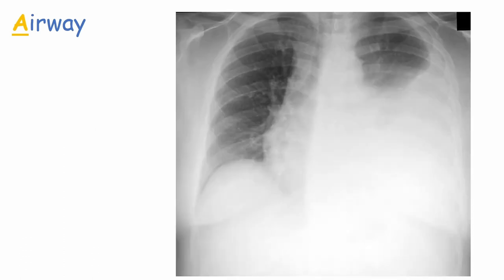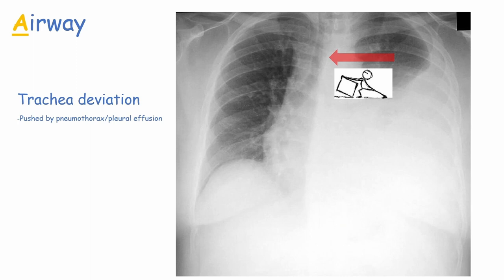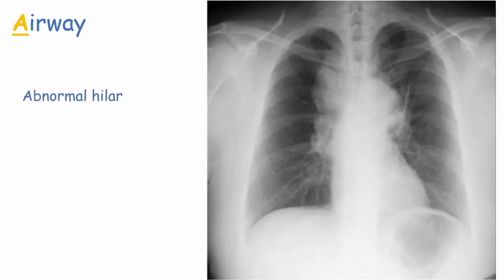This image shows a trachea that is deviated to the right, in this case caused by a large pleural effusion. We can tell it's a pleural effusion because it has a meniscus where the fluid level appears as a curve. The trachea can be pushed by an area of increased pressure, for example a pneumothorax or a pleural effusion, or it can be pulled by an area of decreased pressure, usually a lobe collapse. Hila regions can be unilaterally enlarged, for example in cancers, or bilaterally enlarged as in this chest X-ray, often associated with sarcoidosis.